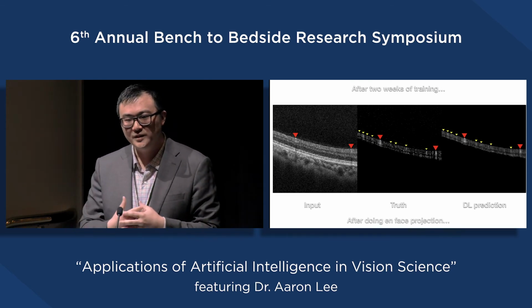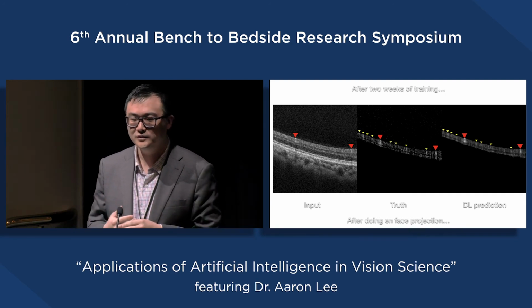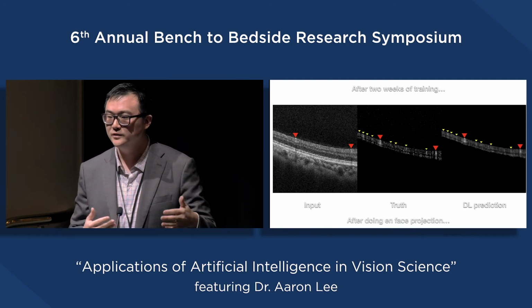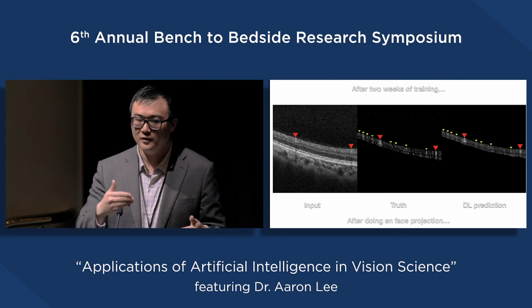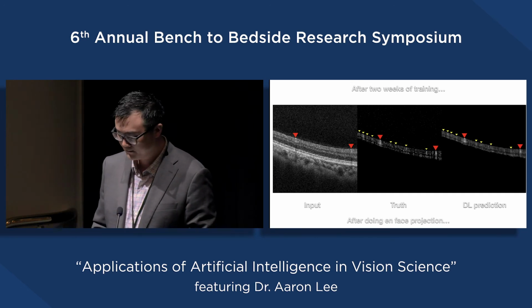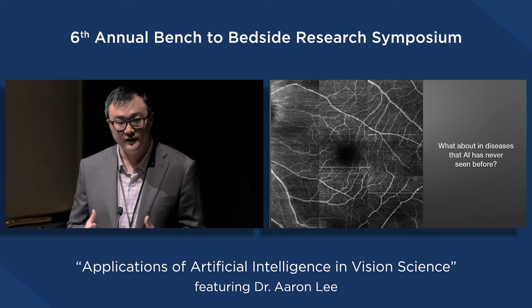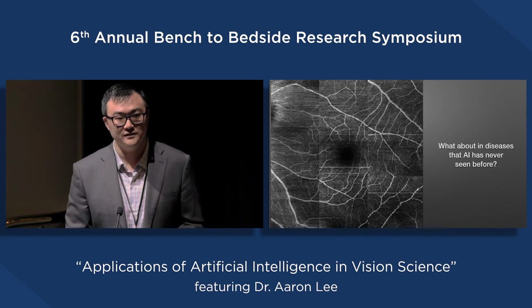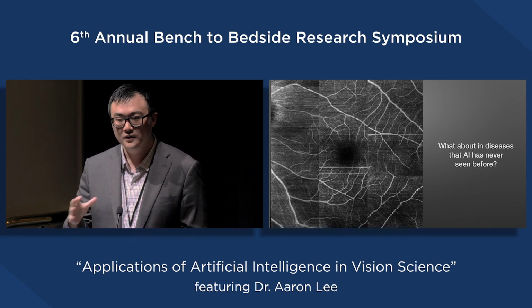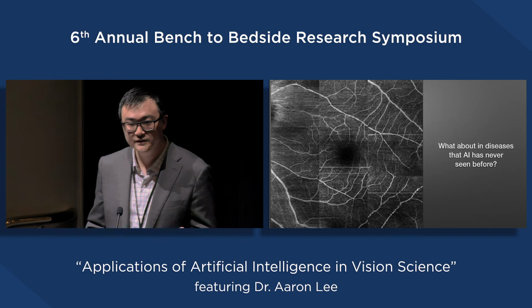And what's kind of nice about this is that this is a deep learning problem where, if you think about it, we've kind of cut out the human in generating the truth here. We've relied on another physical measurement to set the ground truth, and we wanted to push the limits of how far we could train deep learning, where we had sort of an undeniable ground truth to train it with. And so after doing an en face projection, you can get an image like this. And I just want to emphasize, again, this is not OCTA. This is from just simple structural B scans that we could run this deep learning model and turn into what looks like an OCTA.